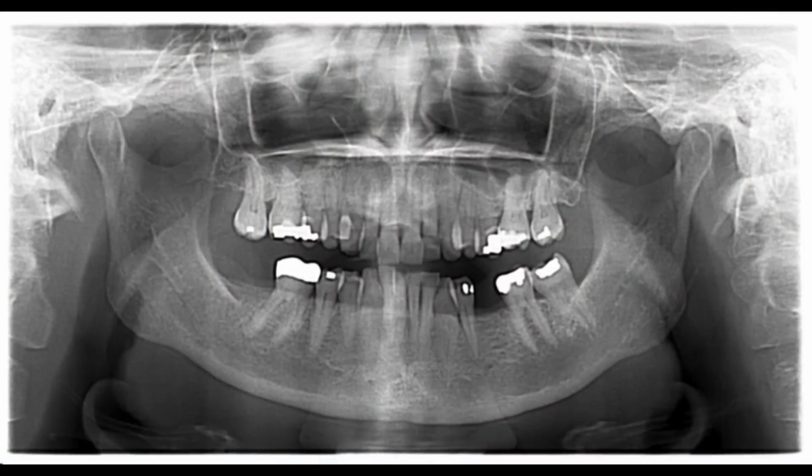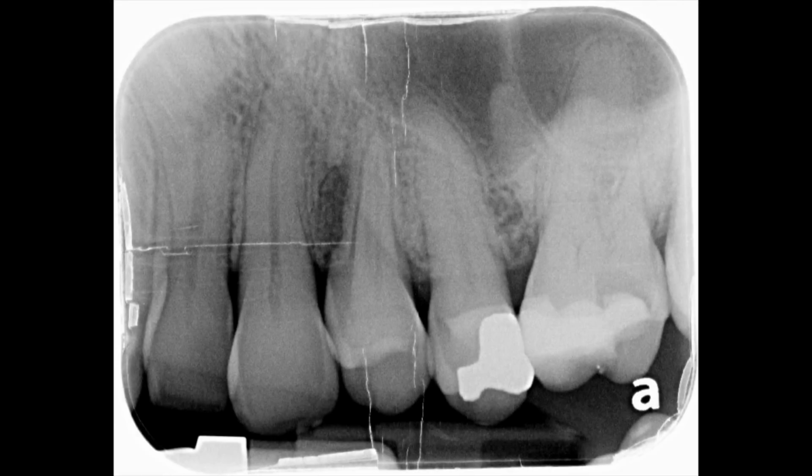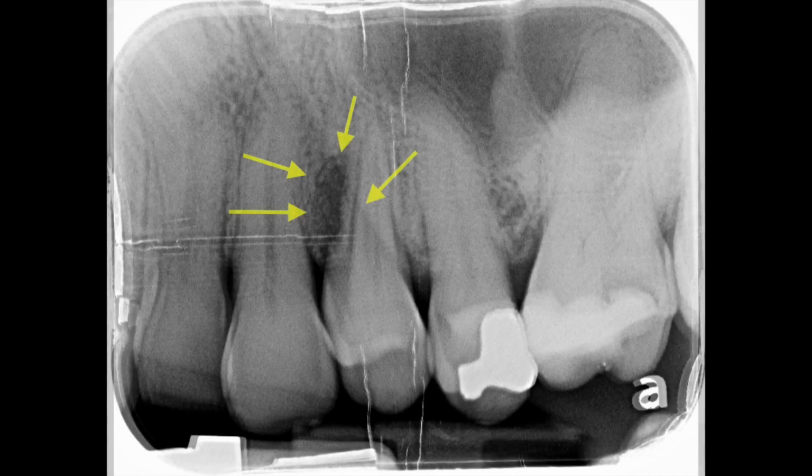So here's a panoramic radiograph of the patient to give you an overview. And the next image is just magnification of the first bicuspid, tooth number 24. And you can see on this image slight radio widening of the PDL. Here's a straight-on periapical radiograph of tooth number 24. You'll notice that it's non-restored, and there is a radiolucency in the middle to coronal third of the tooth. And the next image is actually a shift shot of that same tooth.